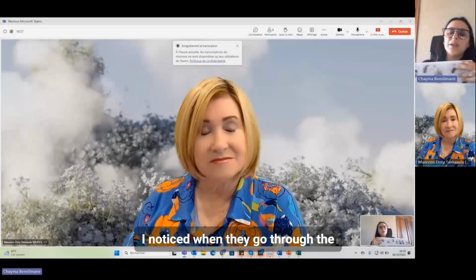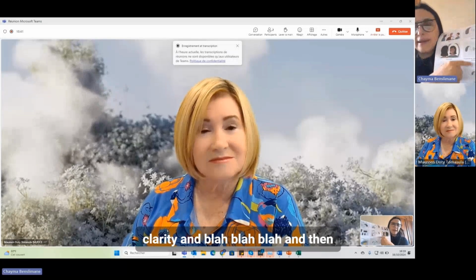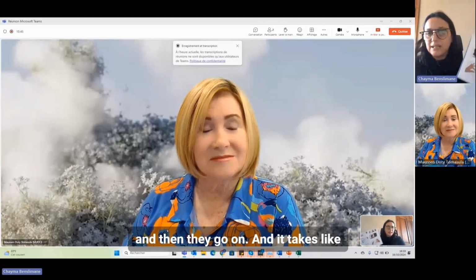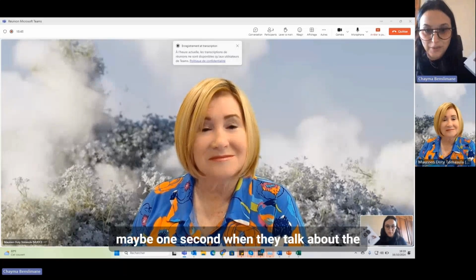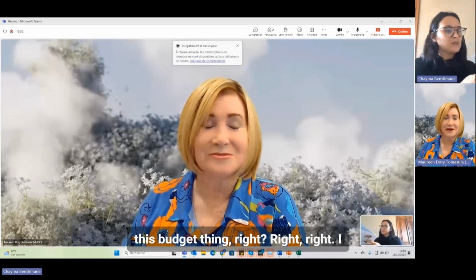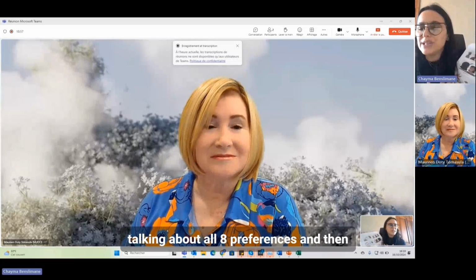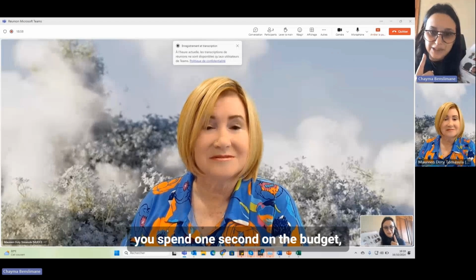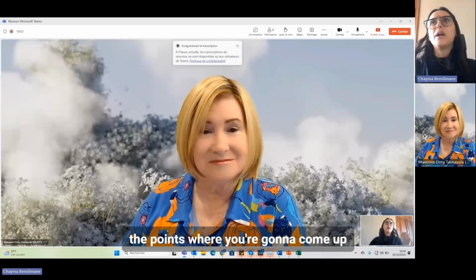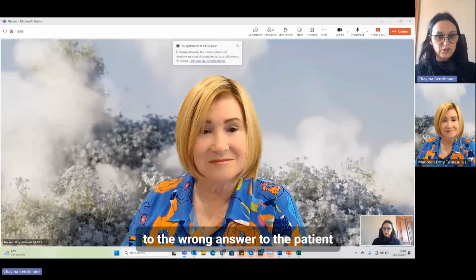What I noticed is that when they go through the preferences, they talk about the clarity and so on, and then they say and the budget, and then they go on. It takes maybe 1 second when they talk about the budget because they are afraid of facing this budget thing, right? I was like, how is it that you talk about all eight preferences and then spend 1 second on the budget? This is really one of the points where you're going to come up with the right answer for the patient or the wrong answer for the patient.